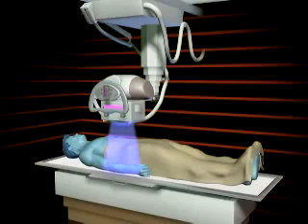These highly energized photons are channeled through a lead cylinder and a series of filters created in the X-ray machine. The X-ray machine then focuses the energy beam at the specific area of the patient's body.